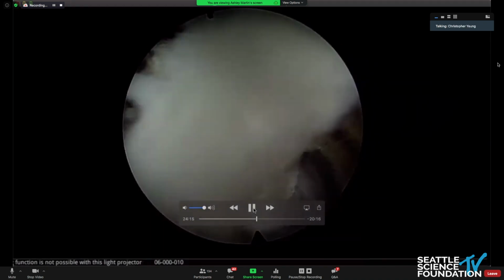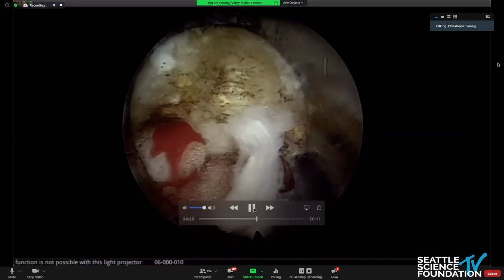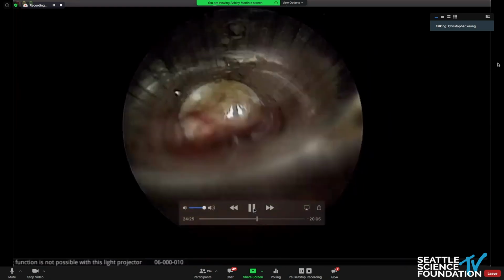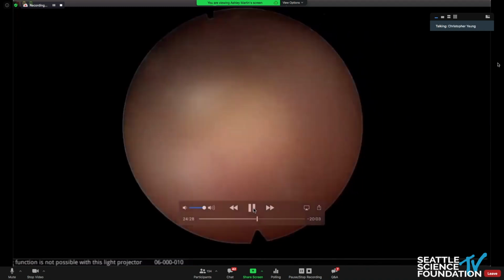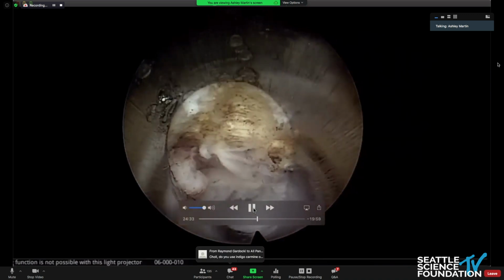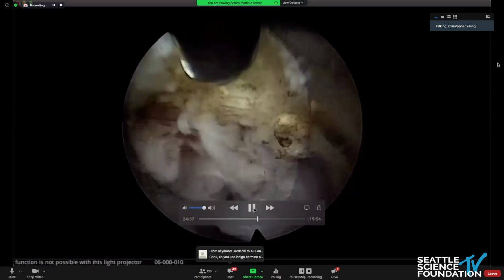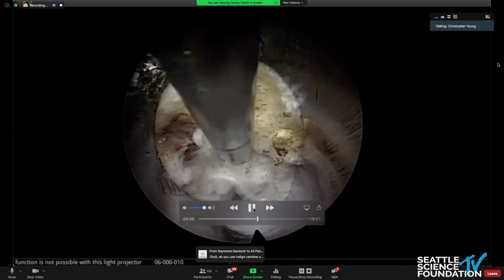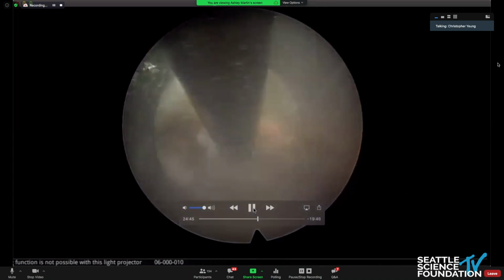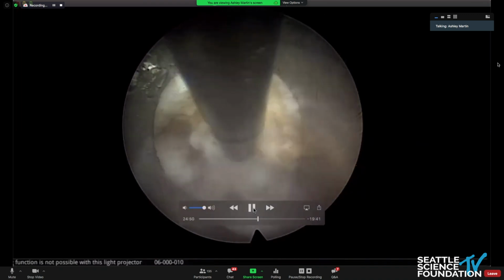Again, the Eloquence with a radiofrequency probe is the workhorse, but if you have the luxury, a side-firing holmium YAG laser is really nice. We're going to show you here how nicely and precisely this can dissect soft tissue and the foramen. The red dot is like a laser sighting, and it only affects where the laser is pointed. Now it's just stripping off that soft tissue. It'll even remove some bone.